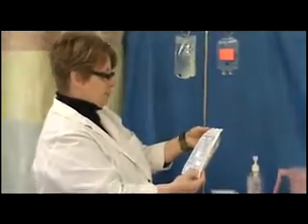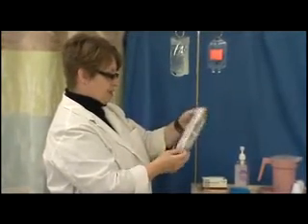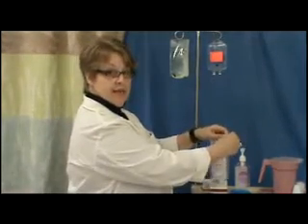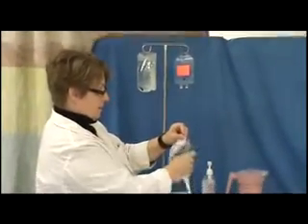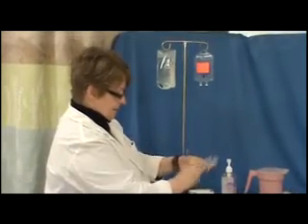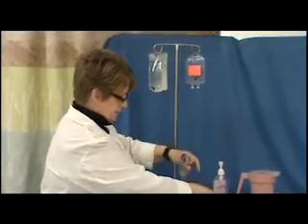You take a look at your primary tubing. Looks good. It has an expiration date. There are no holes in the package. And so you open it. It opens just like a little zipper down the side. You can tear off the extra wrapper. Toss that in there.